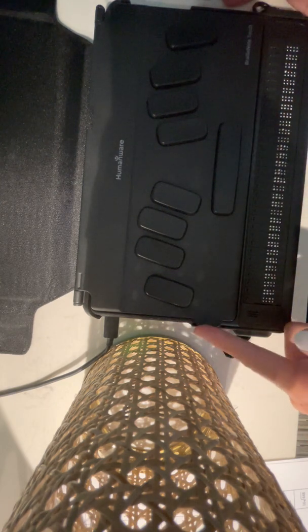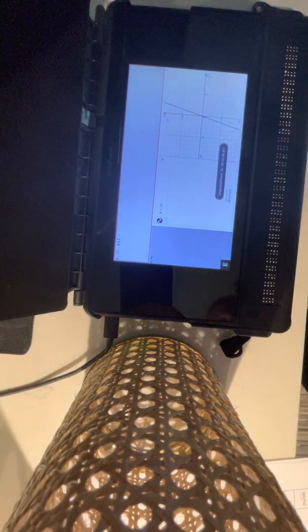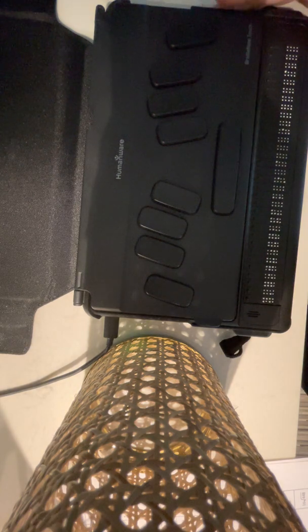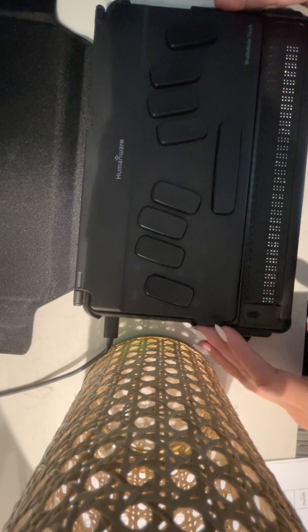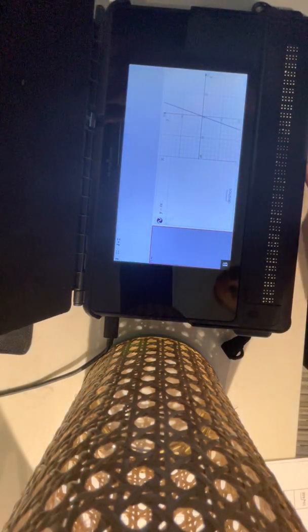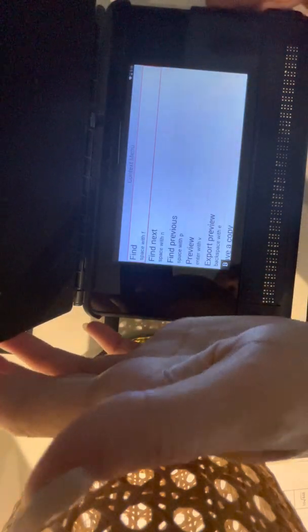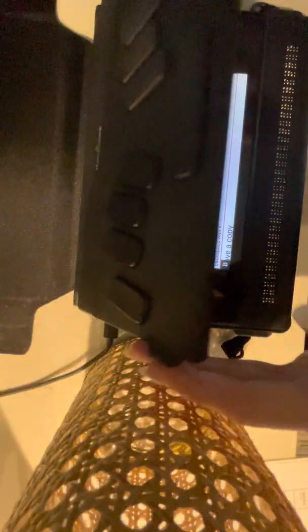Generating graph. Okay. Graph plotted from -20, -20 to 20, 20. Y equals 4x. Bottom. Edit box. Okay. Y equals 4x. Say if I wanted to, let's see what my other context menu options here are. Find. Space with F. Export preview. Let's go ahead and try that. Find preview. Export preview.